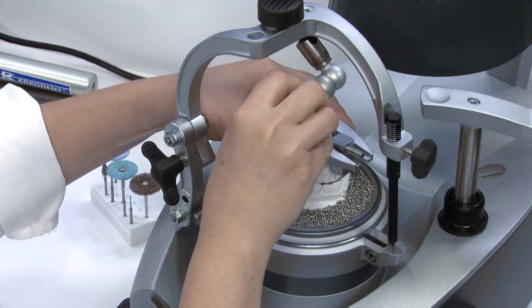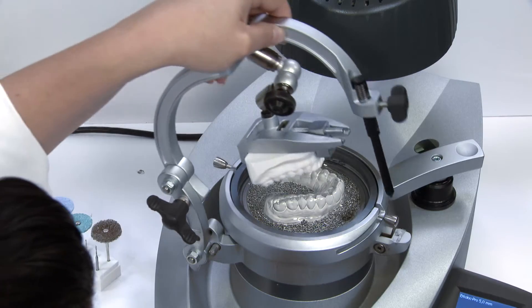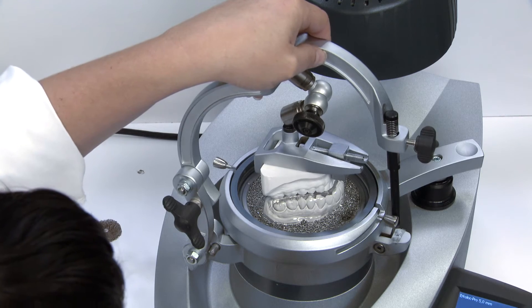For further customization, the ERCOFORM 3 attachment can be pre-articulated and implemented quickly to imprint the opposing bite before the material cools.